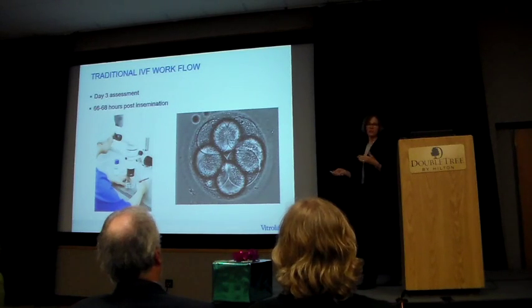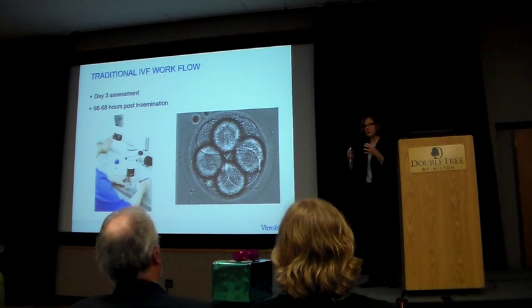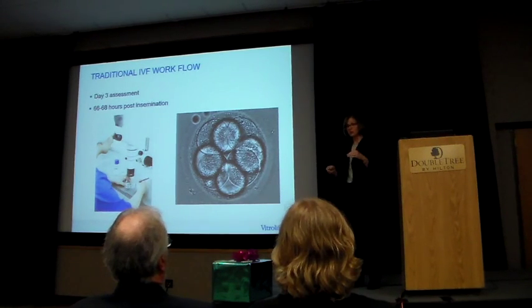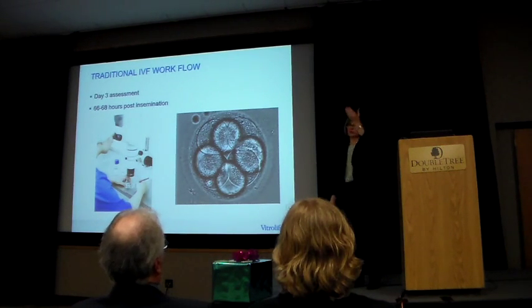So with traditional IVF, you have to remove the embryos from their controlled environment inside that incubator to be able to look at them. Every time you remove a dish, you're exposing that dish and therefore the embryos to a small change in the temperature and the gaseous environment around, even exposure to UV lights. The embryos inside mom don't see a UV light, but when I'm in a lab, I can't work in the dark, so we're going to have some light in the room.